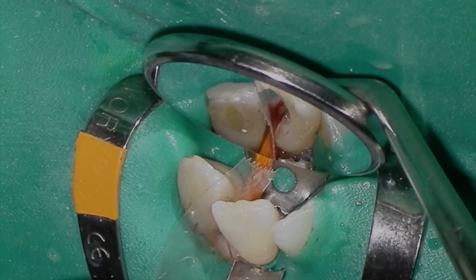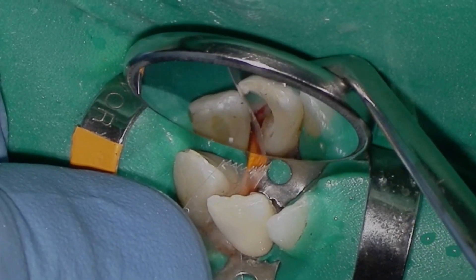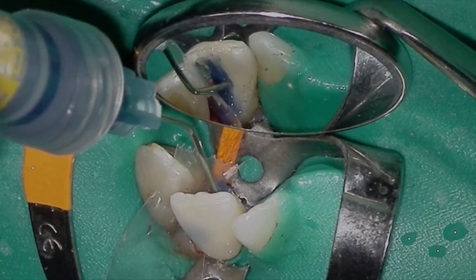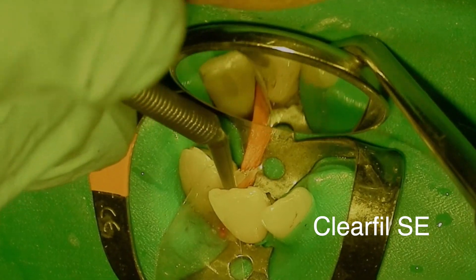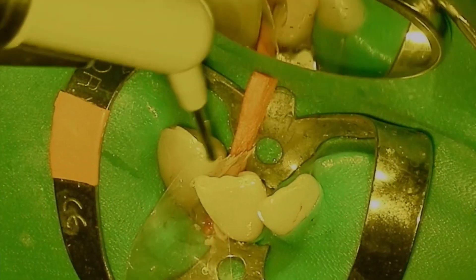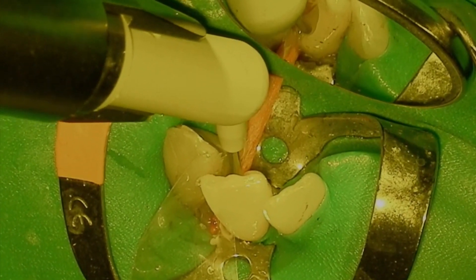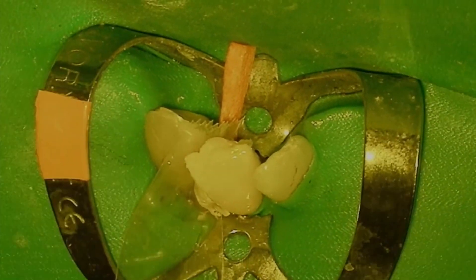I've gotten a mylar strip and wedge into place. Because this tooth is rotated, it's fairly complicated to get a decent restoration in here. We're going to keep the rubber dam on because it serves a number of purposes: one, dentin and enamel bonding is extremely technique sensitive and we want an absolutely dry field; two, we just completed a great root canal — why introduce bacteria into it; and three, it keeps the lips and cheeks out of the way, making everything quicker.